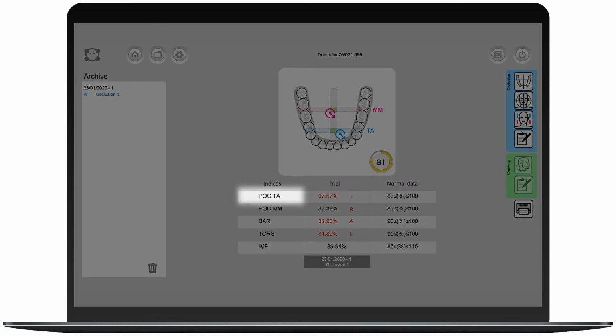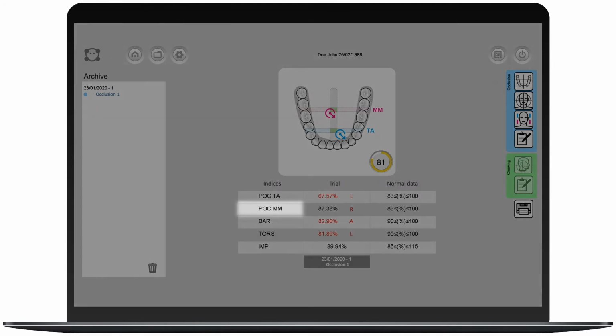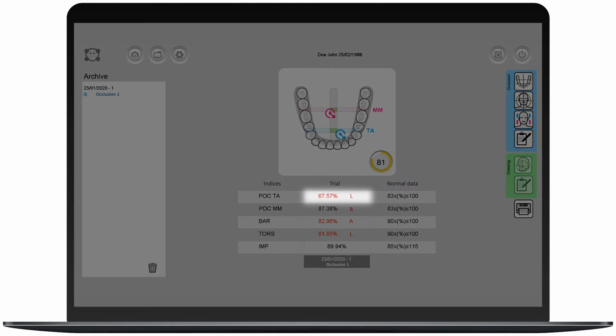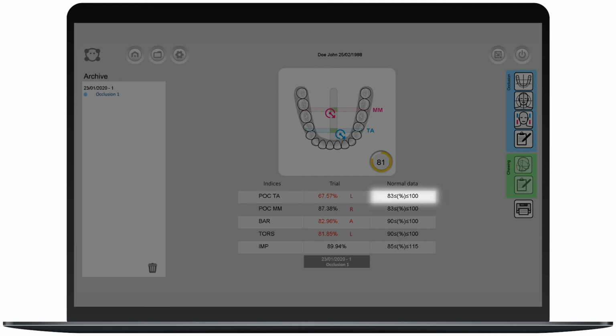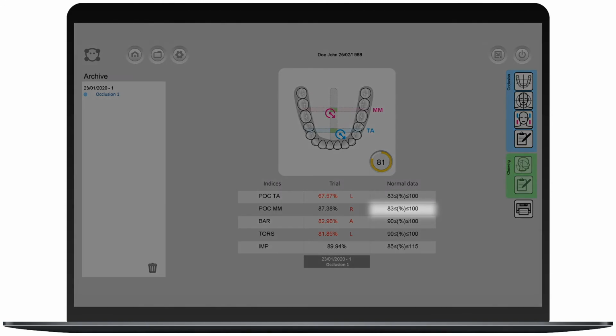The POC index monitors the difference in muscle activity between the left and right sides to identify whether there is a dominance. There are POC values relating to the temporalis and the masseters. In this specific case, the temporalis POC is 67.57%, outside of the normative range. The letter L indicates that the left temporalis muscle is working more. The POC of the masseters is 87.38%, which is within the normative range.